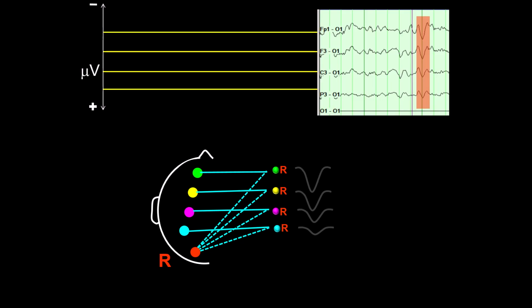I would like to stress that this pattern is one of the two major categories encountered during reviewing of common electrode reference montage. This pattern is called the no phase reversal pattern. This pattern, when encountered while reviewing an EEG using a common electrode reference montage, indicates that the reference electrode is either at the minimum or at the maximum of the electrical field, as we have previously mentioned.